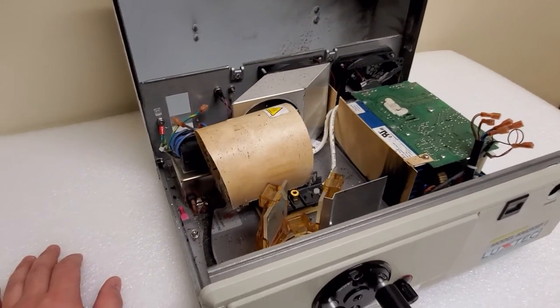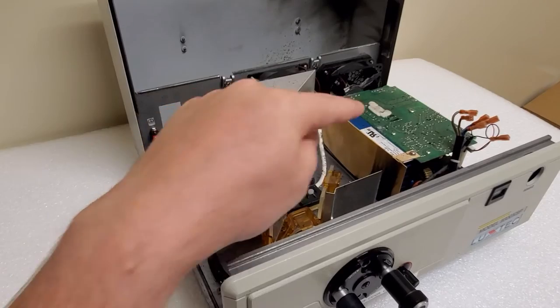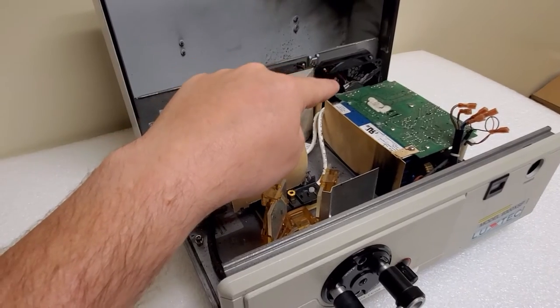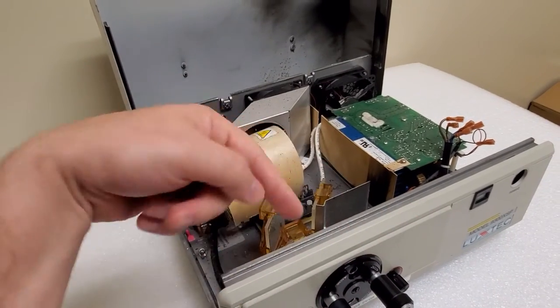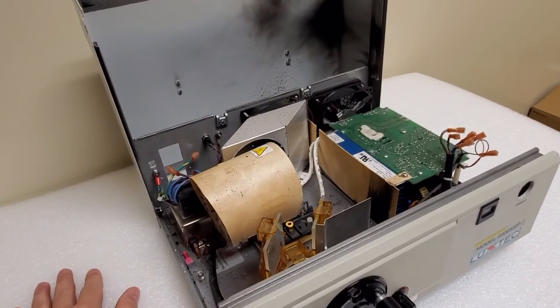So there's a couple things going on with this light source. The bulb - when bulbs get older, they draw more current to keep the arc going, which makes the power supply work harder. And back there, the fan is so chocked full of lint that it doesn't spin naturally. Normally with a brushless fan you can spin it and it will continue spinning for a couple seconds, but this one barely spins and stops immediately as soon as you quit forcing it.